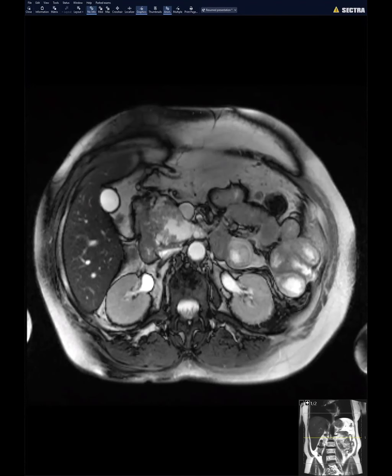So can I ask folks a question about that? This is Manjul, sorry to jump in late. What do folks do in terms of protocoling these with or without contrast, especially now with COVID and trying to reduce MR time? Are you asking about follow-up of routine IPMNs, like tiny, small ones, or the more malignant-looking ones? My question is about all of the above.